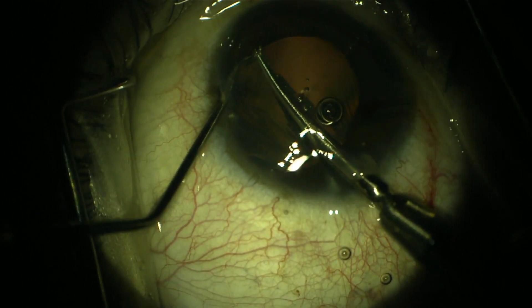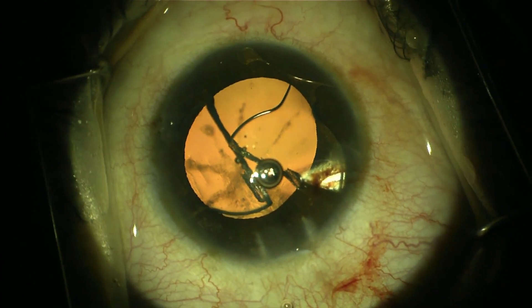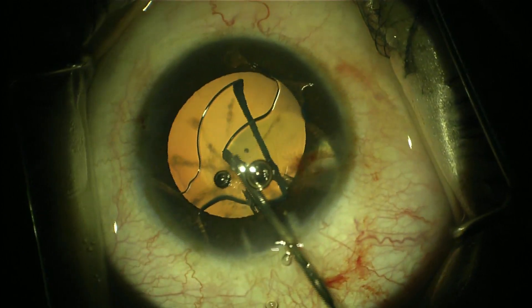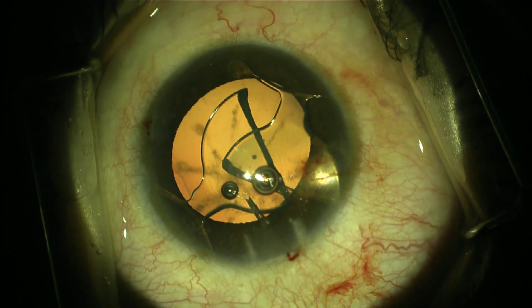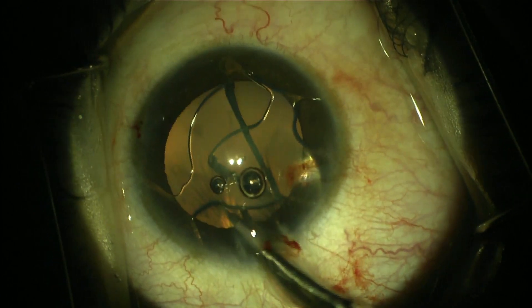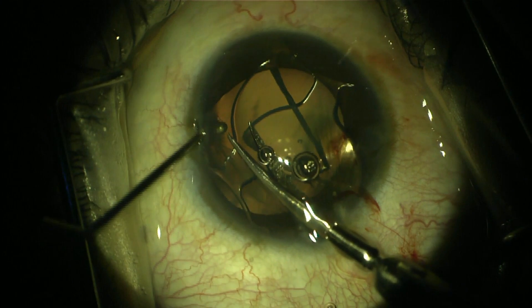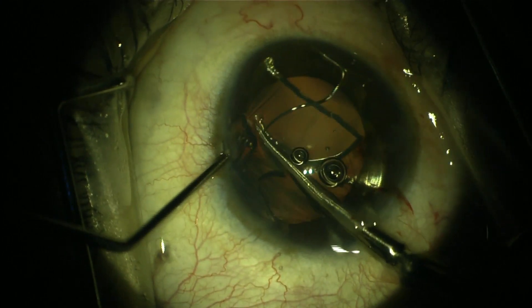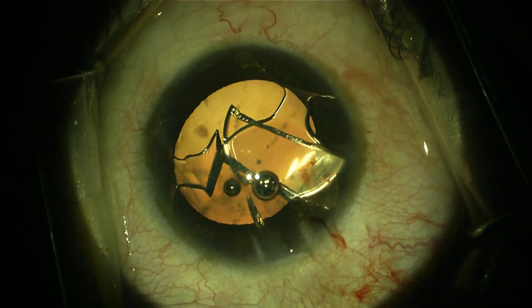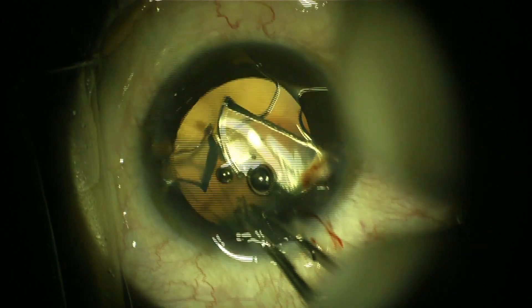I used a dispersive viscoelastic material to protect the corneal endothelium and removed the IOL through a small incision of 2.2 or 2.4 mm. Using micro scissors, I cut the IOL into three pieces, then used forceps — such as Pearce or micro-serrated forceps — to take each piece out from the anterior chamber.